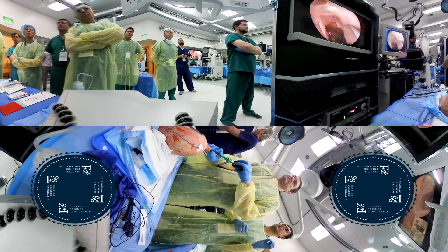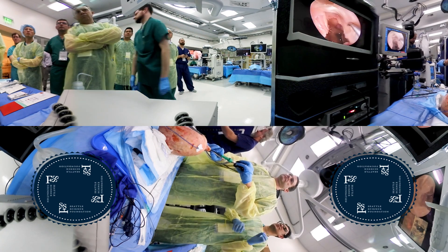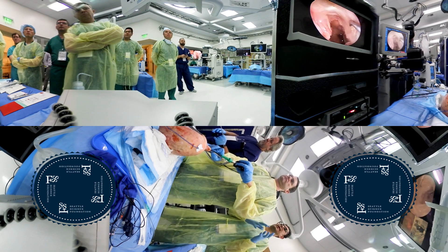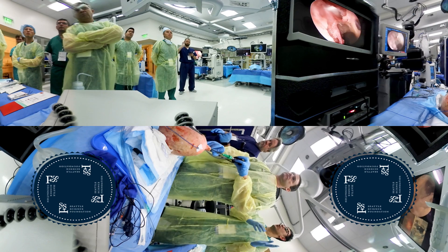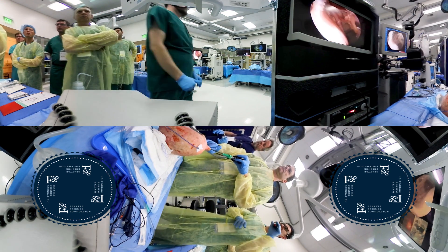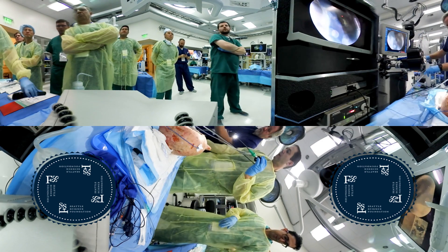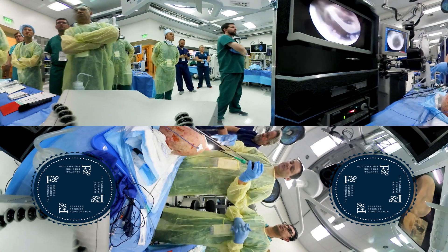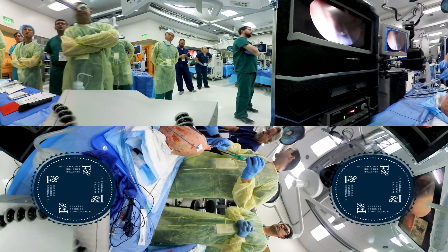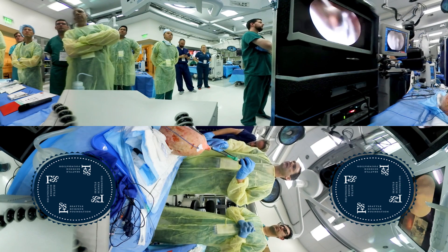You're not crazy when you say the bone seems thicker. The actual inflammatory process inside the orbit can extend towards that bone — I think that is a reactive process for the ethmoids. The ethmoids actually do get a little thicker in thyroid eye disease. We'll take the spear knife, and there's also a U-shaped blade over there in that kit.